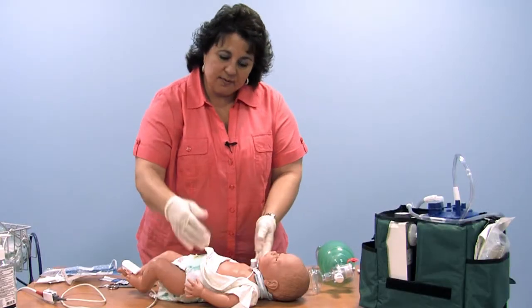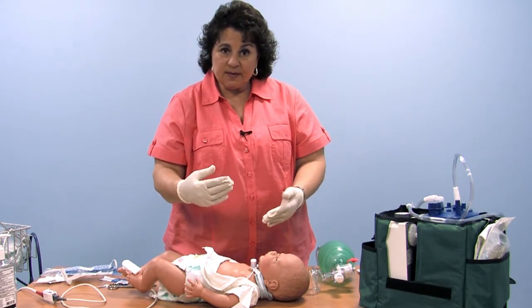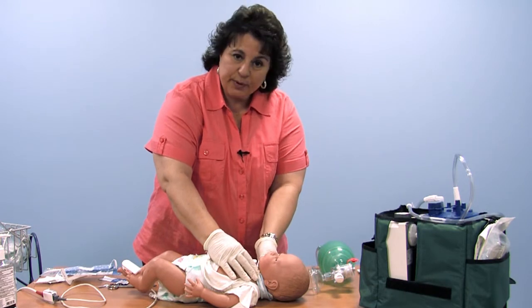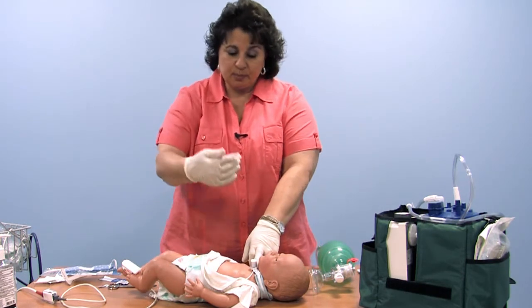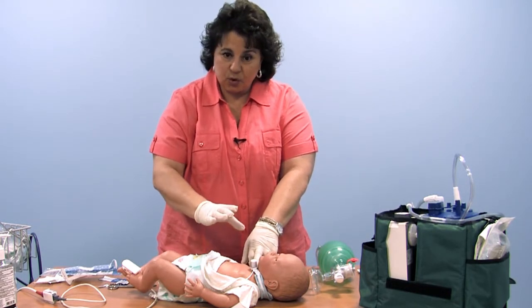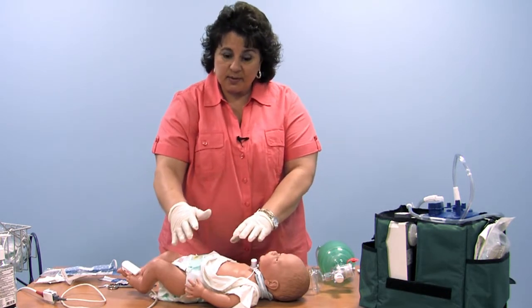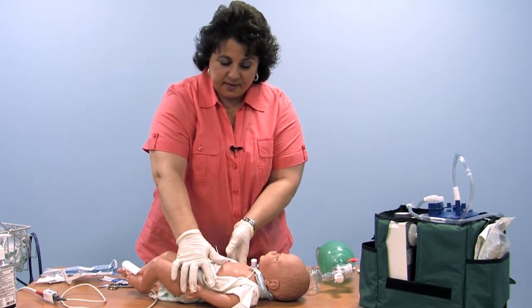So the role of the second person with regard to this trach change is to hold the tube in while the ties are removed, remove the tube when the person that's going to replace the tube directs you to do so, and help hold it in place until everything is secured. We also have arms and feet sometimes to worry about, so we talked about papoosing or wrapping a blanket around the arms to keep them down at the side.